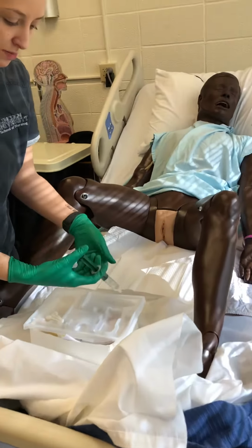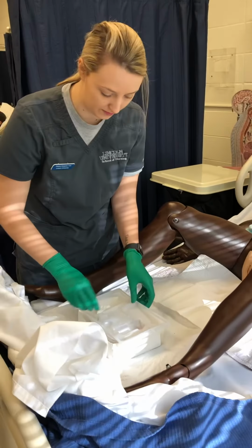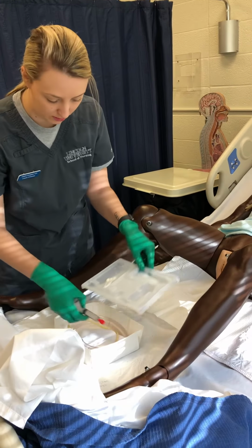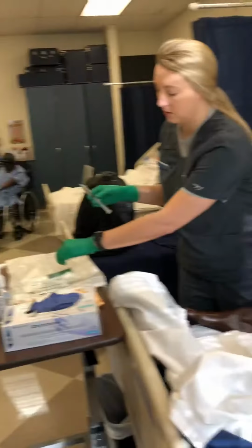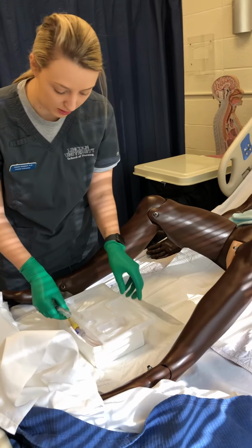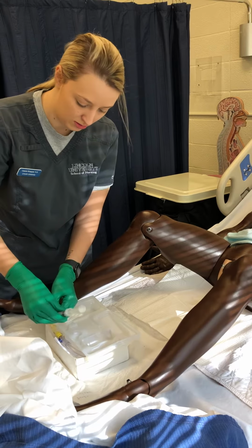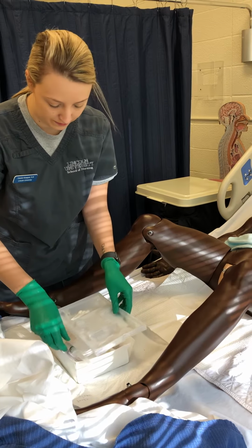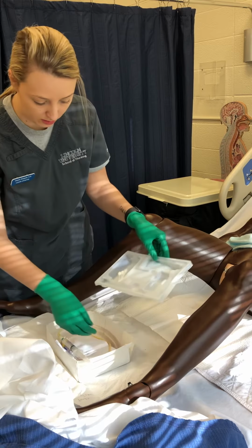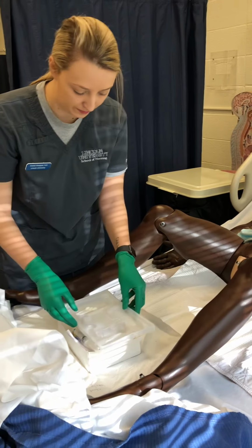I would be squirting my lube in here, but for the video, I'm just going to save it. I would check hospital policy to see if I should inflate the balloon, but for this policy we do not, so I'm just going to attach it. Okay, and then I would also lubricate my end a few inches in my lube.